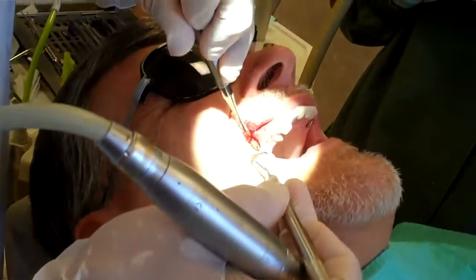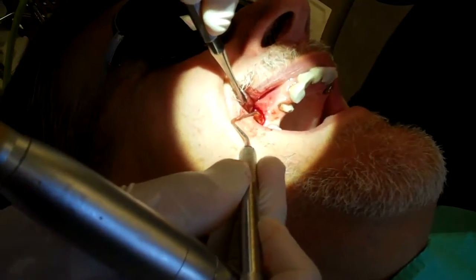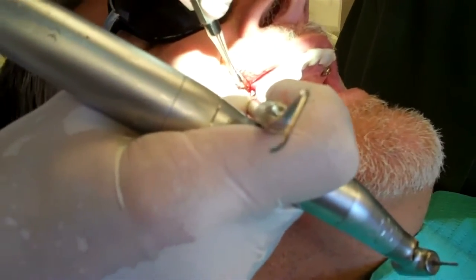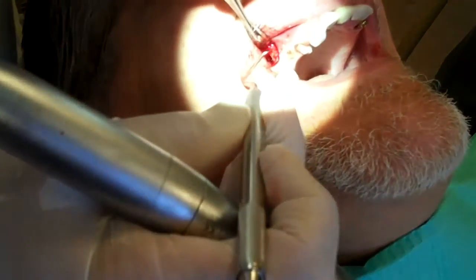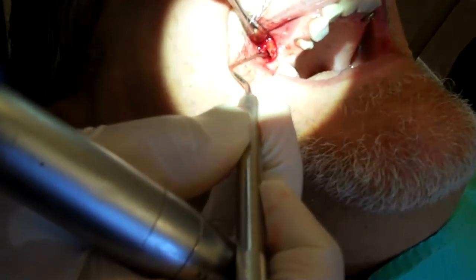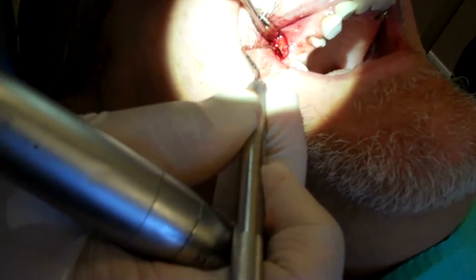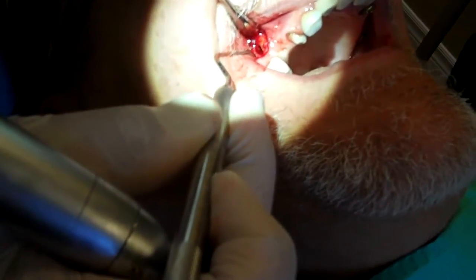Okay, so this is actually the one root of the tooth. You can see that little orange spot right there is part of the filling that's filled the root canal. What we're going to do is shorten that up a little bit in that area, fill that up from behind, and then fill this area up. His sinus is very, very infected in this area, so he's had some problems with that in the past. So we're going to go ahead and do that.